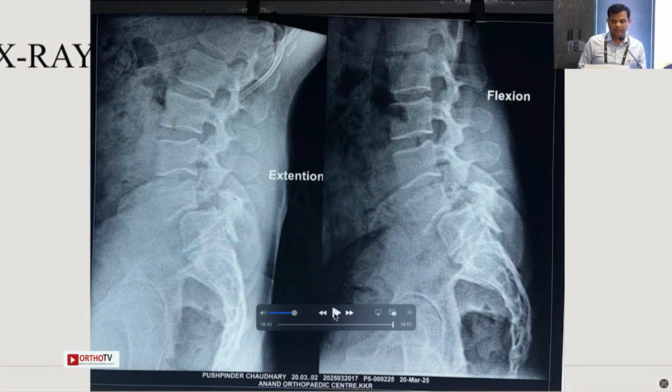Okay. So the real advantage, one is the radiation. That's one of the most important. If you are using navigable screws, for you as a surgeon it is completely nil. For the whole team, when you take a spin, everybody goes out of the operation theatre, so for them also it's almost nil.